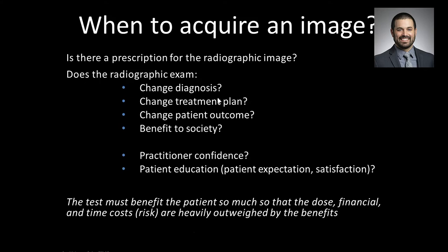Many times it'll change your diagnosis as well, but this is the question you need to be asking yourself. Even if acquiring that 3D information or that radiograph influences a treatment plan, even in the slightest manner, it's worth getting. Ultimately, we should be thinking about patient outcome and society, but on an individual practice basis, those are hard to answer. You need studies to do those. Practitioner confidence and patient education alone are not good reasons to standalone order cone beam CT.